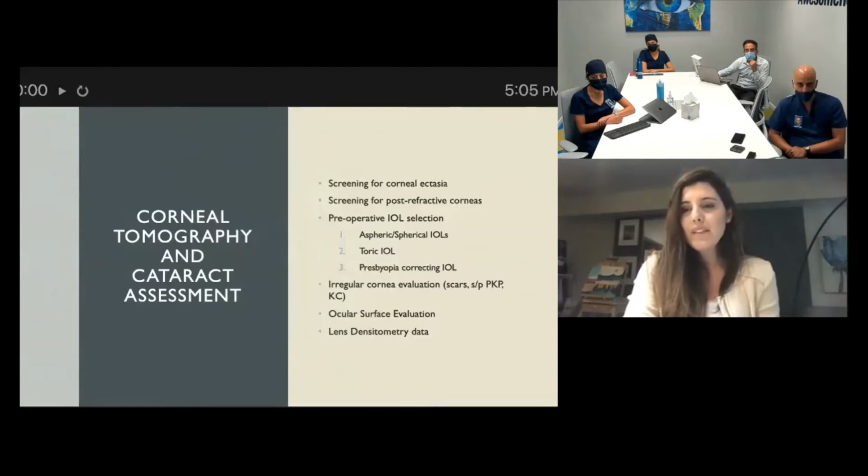Also, you always have this unhappy patient who is 20/20, but he or she either has a change in myopia, an advancing myopia, still getting to 20/20, or has a change in astigmatism, ever so frequently changing glasses. And on exam, his lens looks totally clear grossly, but when you look at the Scheimpflug, you can get data for lens densitometry, and that can give you an idea of an early cataract that's forming, and that can explain his changing symptoms.